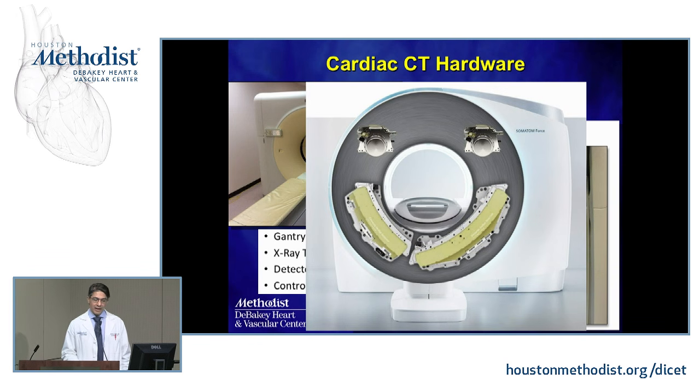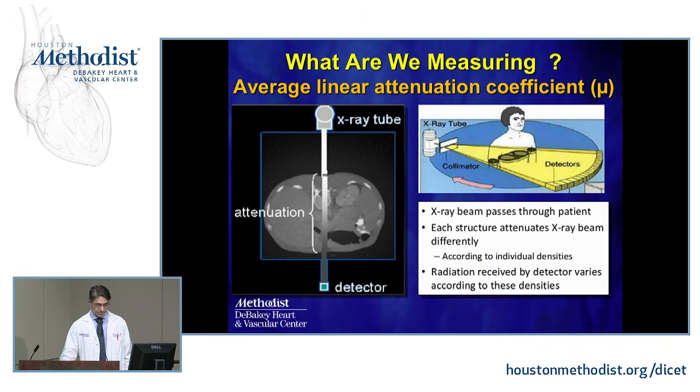Nowadays, I wanted to mix old with new. You've seen a progression from the 64 slice days to what we have now, these dual source scanners. They have very similar components, but you have a second head mounted at 90 degrees. This is the arrangement you would see if you took the bore cover off of those scanners.